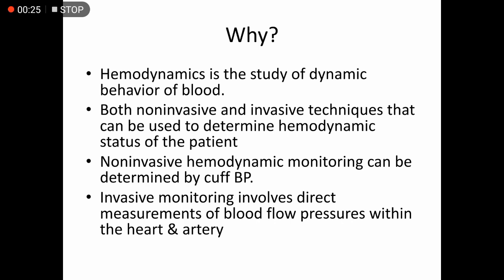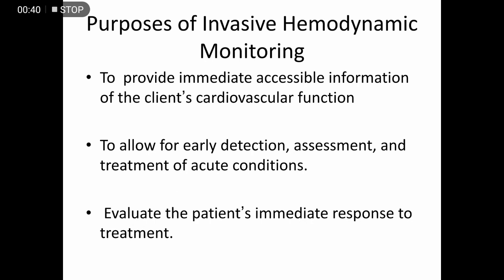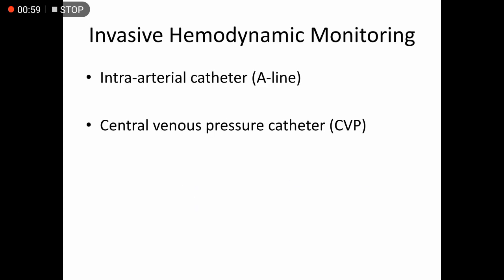Non-invasive hemodynamic monitoring can be done by cuff blood pressure, what we call non-invasive blood pressure. Invasive monitoring involves direct measurement of blood flow pressure within the heart and artery. The purpose of invasive hemodynamic monitoring is to provide immediately accessible information on the client's cardiovascular function to allow for early detection, assessment, and treatment of acute conditions, and to evaluate the patient's immediate response to treatment.